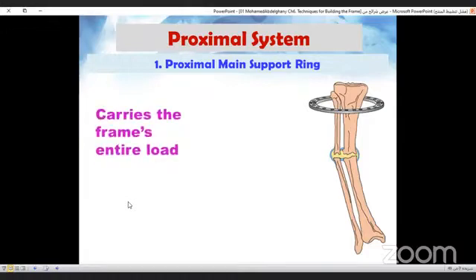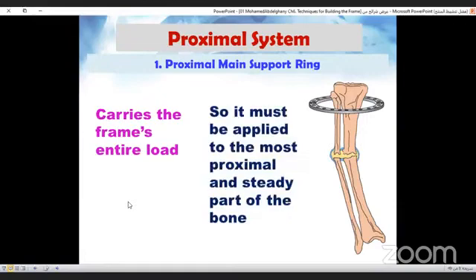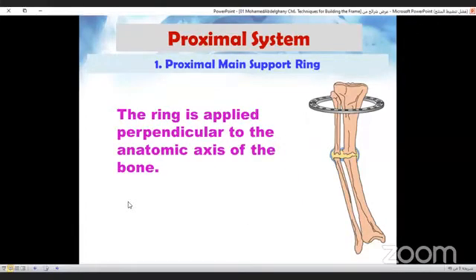This ring carries the entire frame load, so it must be applied to the most proximal and the most steady part of the bone. The ring is applied perpendicular to the anatomic axis of the bone.